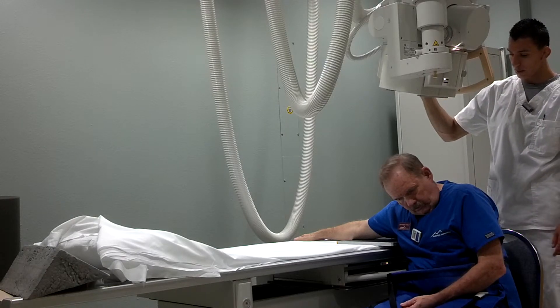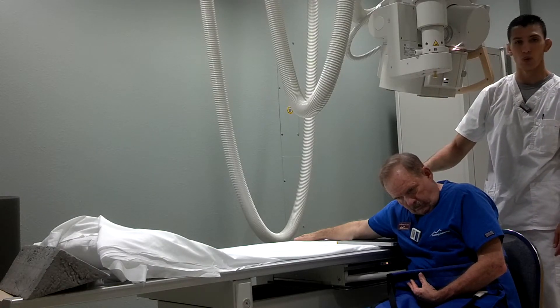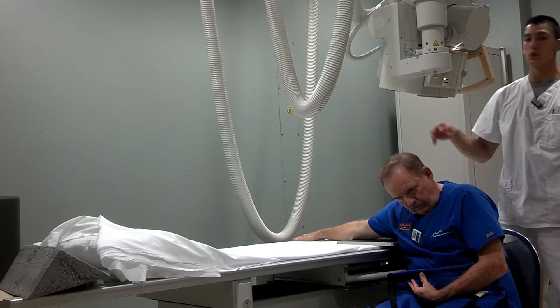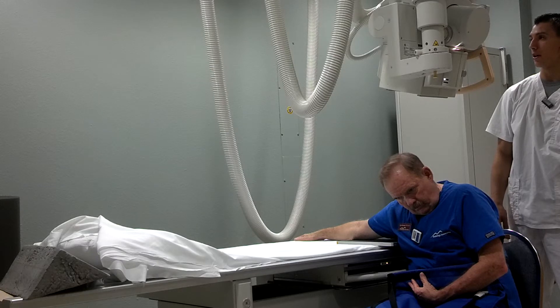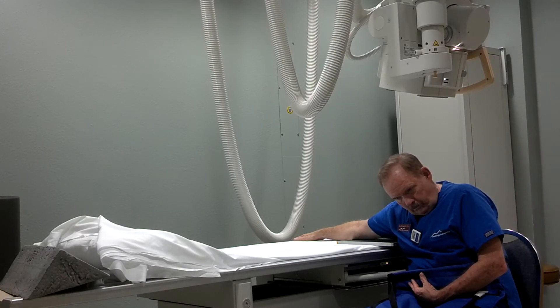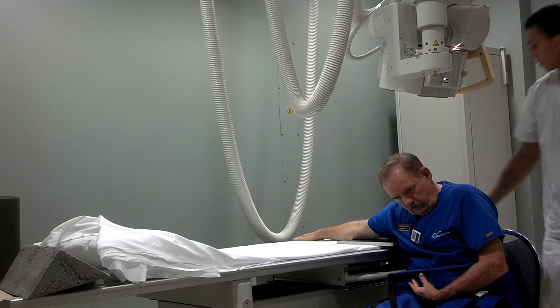The central ray is going to be perpendicular to his shoulder joint, which is right around the dimple on his shoulder there, and angled distally towards the elbow about 15 degrees. Make sure that we put our marker on there as well for the right shoulder.